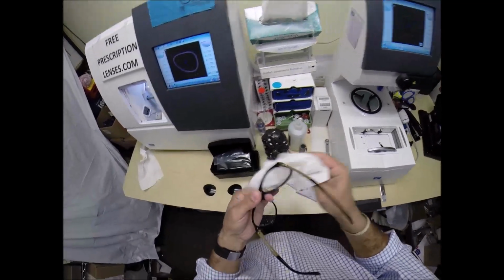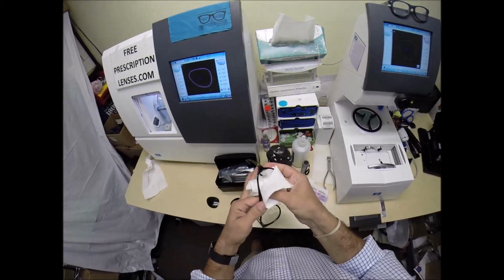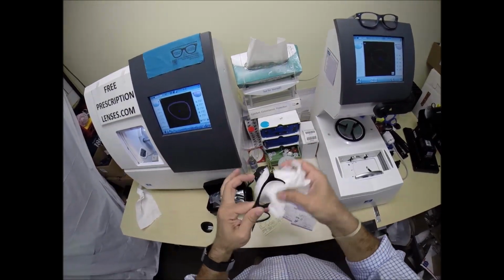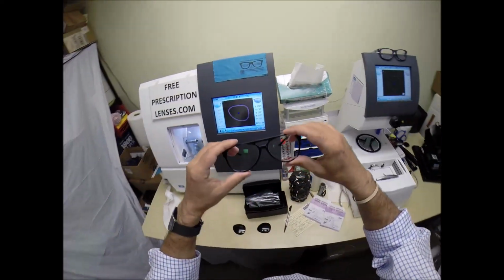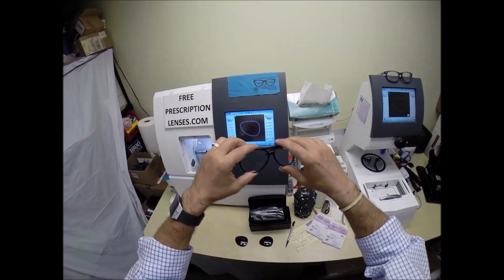However, there's an 80% chance that one side is going to sit higher than the other. That's because 80% of people have one ear that's higher than the other, and because of that statistic, 99% of all optical shops will do free adjustments, never asking where you bought them at. So just stop in your local place, tell them if it's too loose or too tight or high on one side. It only takes about 30 seconds to a minute to adjust a pair of glasses perfectly.